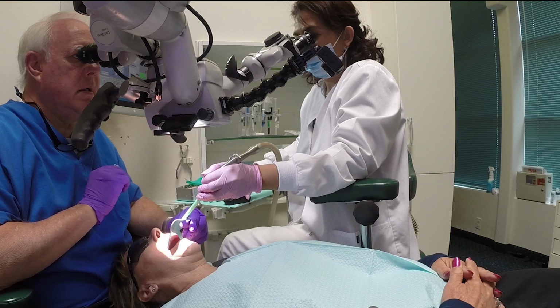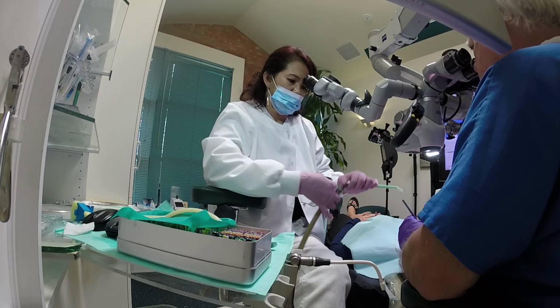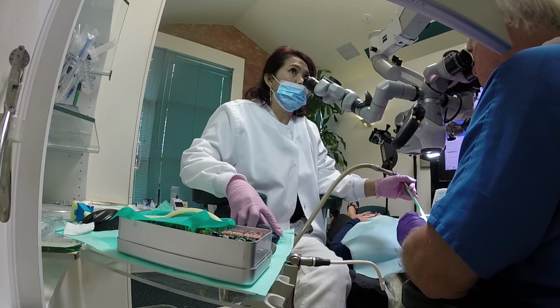From another angle, starting right from the beginning, she takes the intraoral mirror. This is in slow motion, so you can see exactly what she's doing with her hands. Again, she's upright, completely comfortable. She takes the suction in her left hand, looks down, positions it correctly, and now she's ready to take pictures.